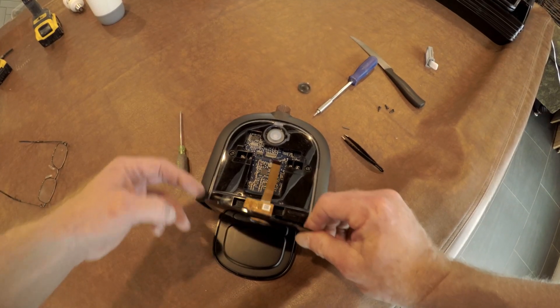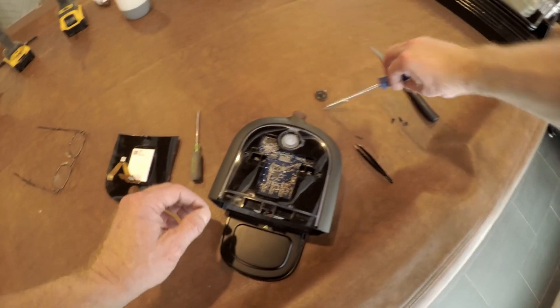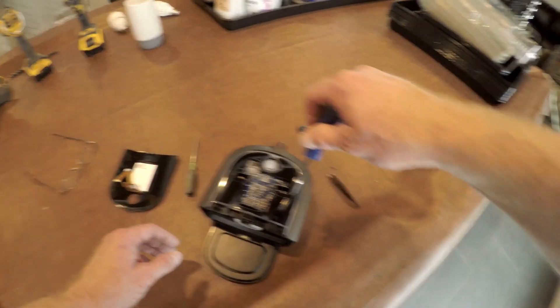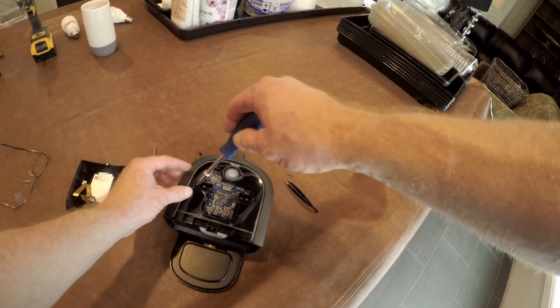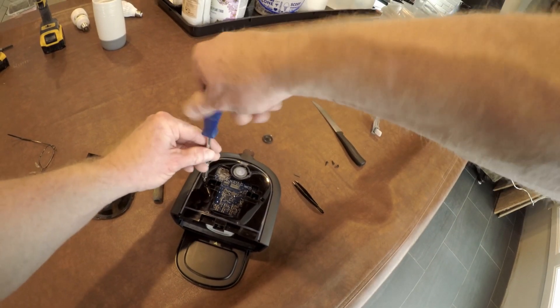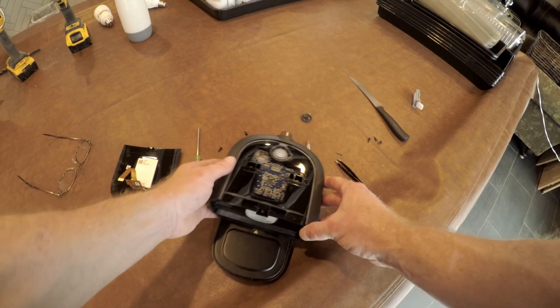Then the ribbon cable is just laying there — that takes care of that. There are two more Torx screws here to pull loose. Take those out and that's it for the Torx screws. Just five Torx screws holds it all together.